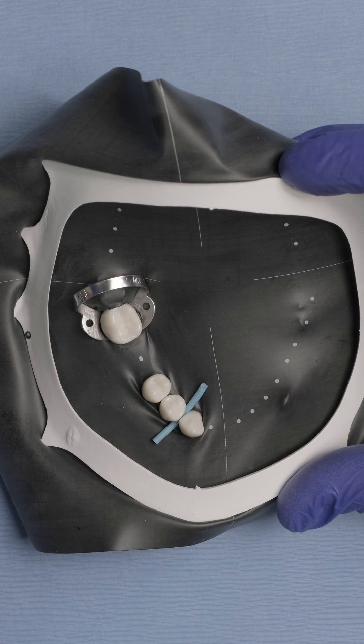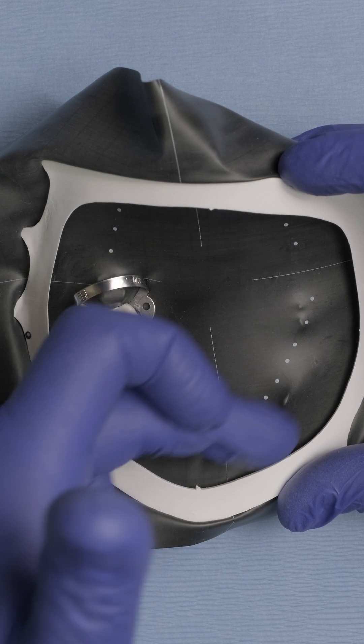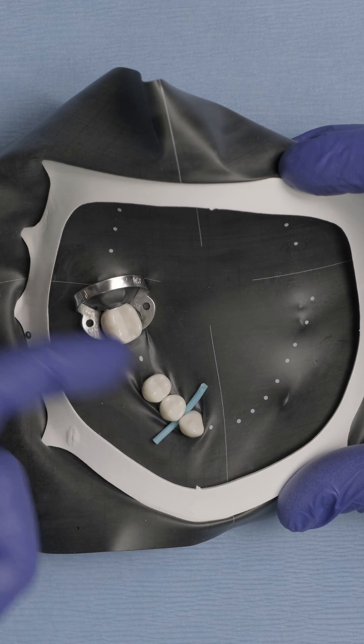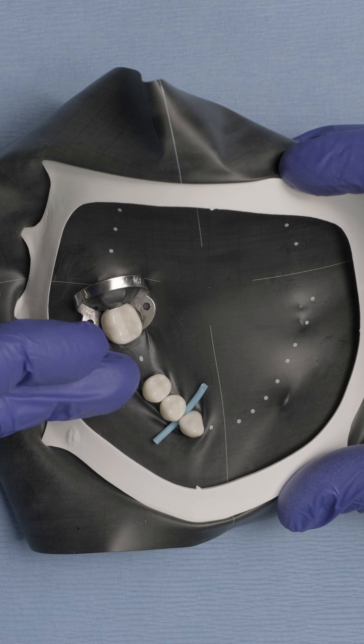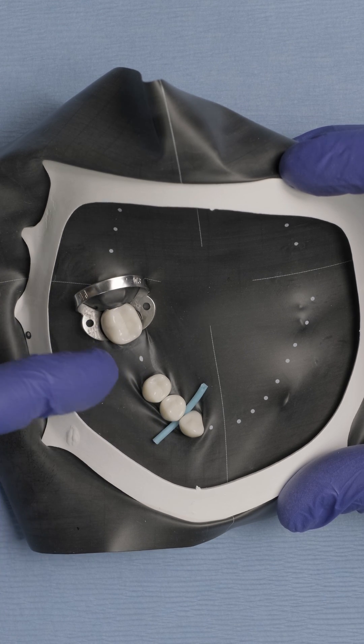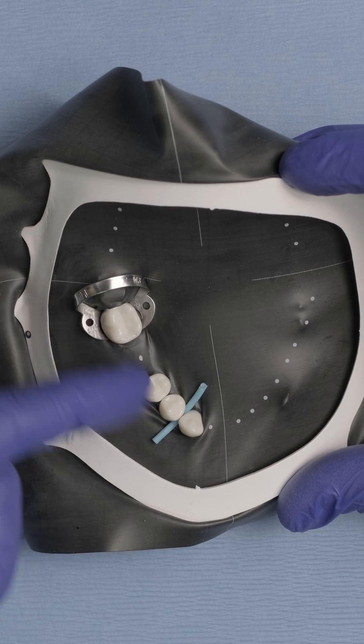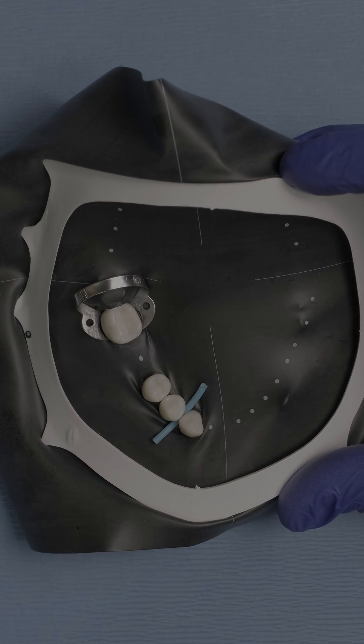which as you know is crucial during operative procedures. Keep in mind how easy this was, just because we have a pre-printed pattern. We know exactly where to perforate and where not to perforate, so we can accommodate for any missing teeth in the arch.